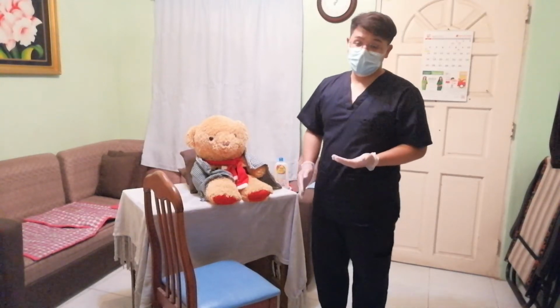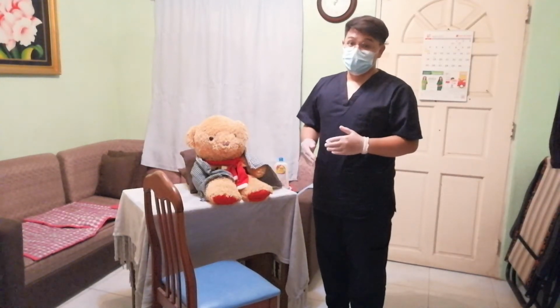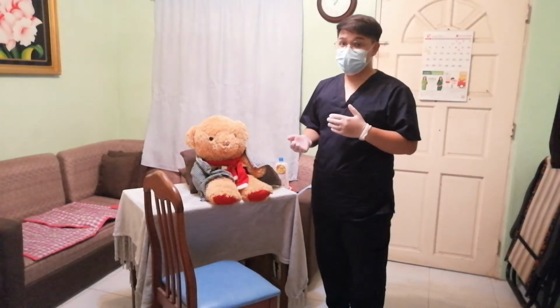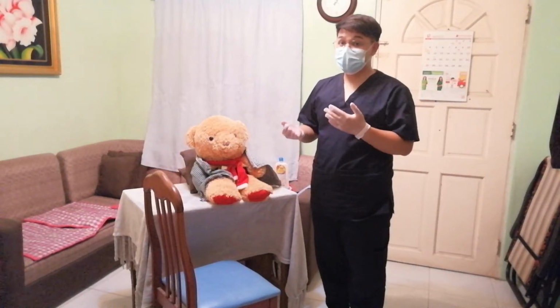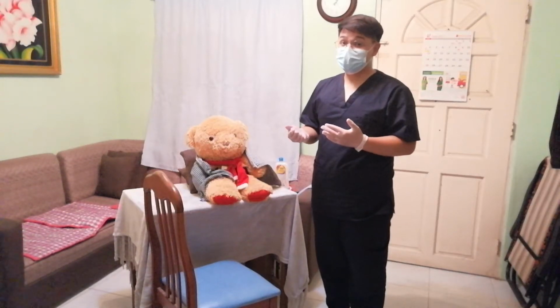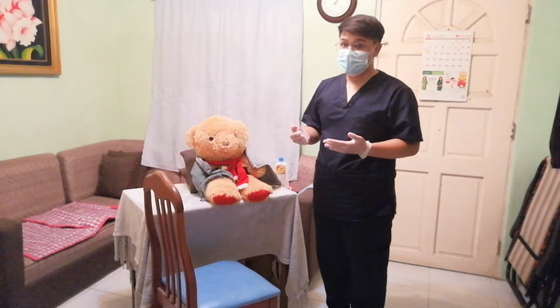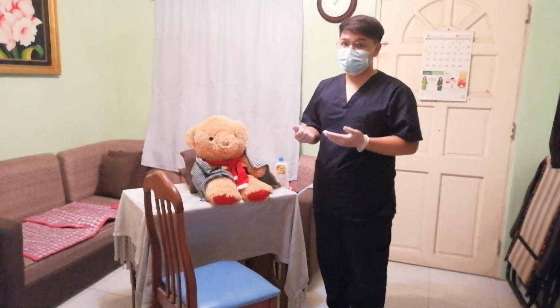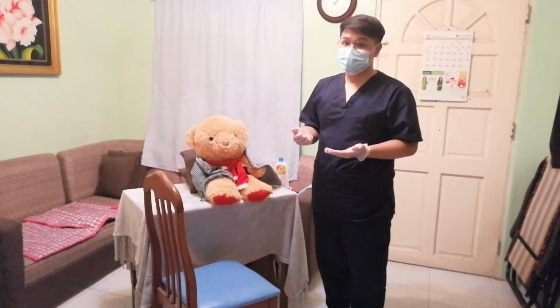We will now proceed to our next step, which is we need to position ourselves close to the patient as much as possible, and also we need to position our foot on the outside of the patient's foot. And also if the second staff is assisting, we will need to have him or her assume a similar position.